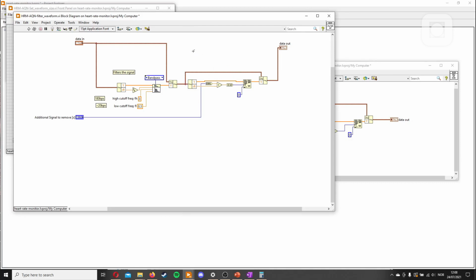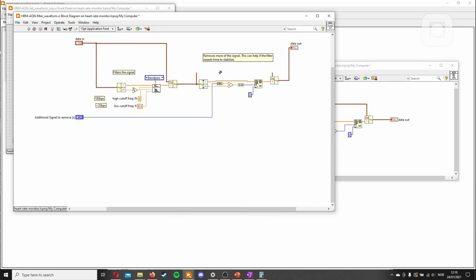So we'll just add a comment here. Removes more of the signal. This can help if the filter needs time to stabilize. And there you go. So this is this part. And we can just move it a little bit away from the other part so we can see the difference. And let's try this function out.